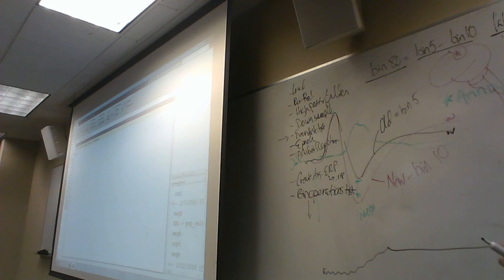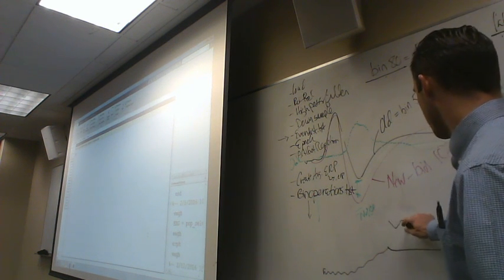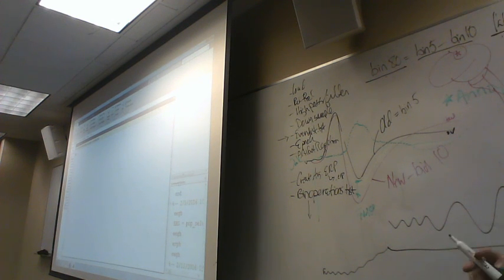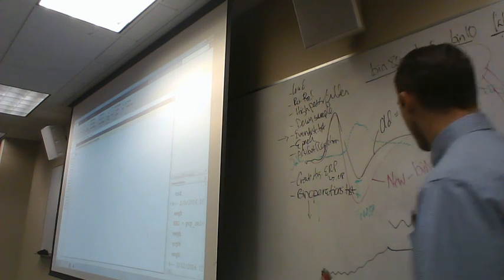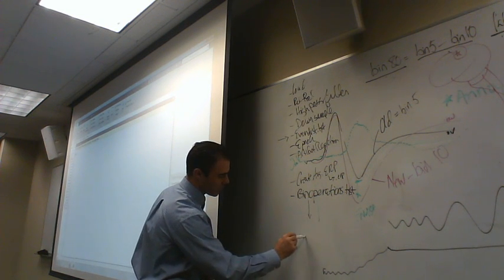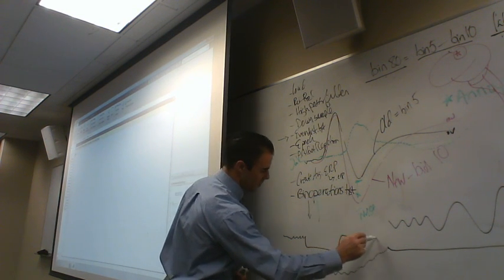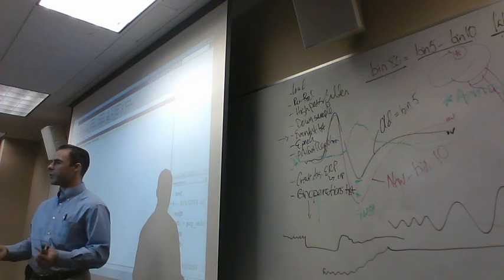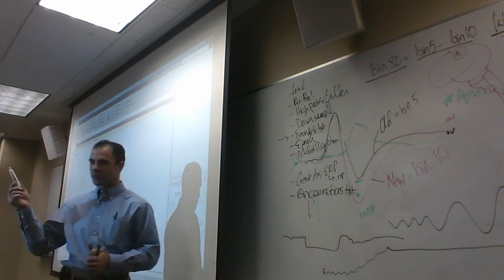Blocking, exactly. Now, we also had a different pattern, EEG and then alpha waves. A lot of times you're going to see alpha in the occipital electrode sites. They have a lot to do with drowsiness and things like that. What if you had an electrode that was coming out this way, recording, and then it went this way? Yeah, saccade. That'd be one of the ocular artifacts. Good job.